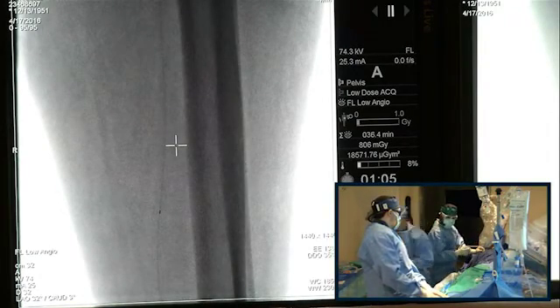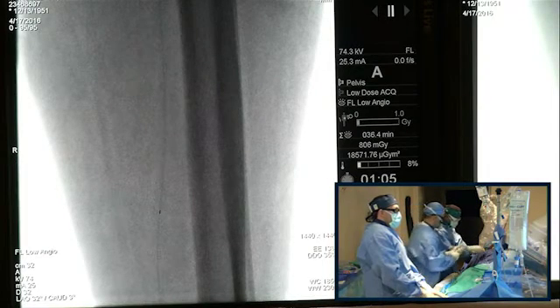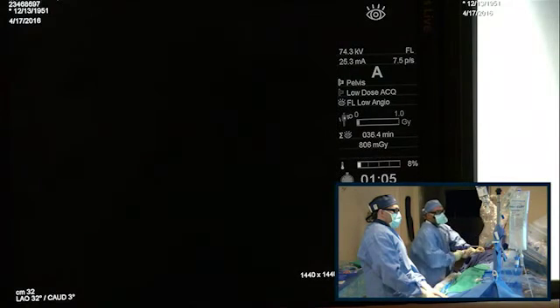Right there. Part of it is, though, I think it's a 3 millimeter balloon and a vessel that has a lumen diameter of about 2. So every time, as Bruce mentioned, you dilate it, it's going to look a little worse right at the distal edge of the dilatation segment. Dr. Manzi, would you use coronary stents here at all if you need to?